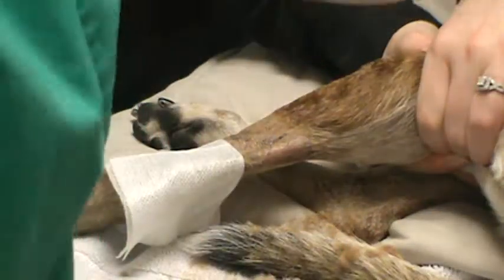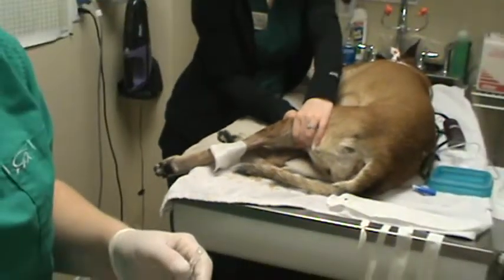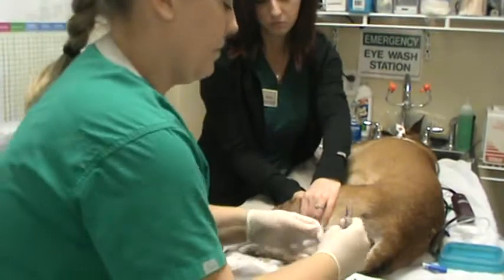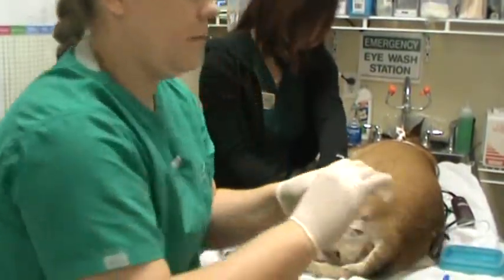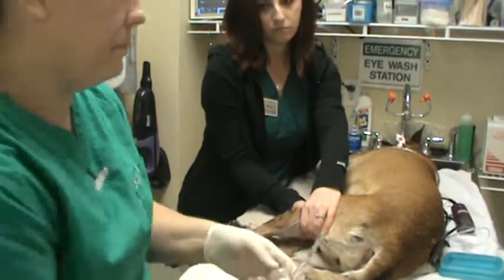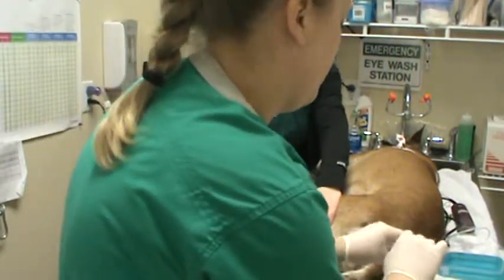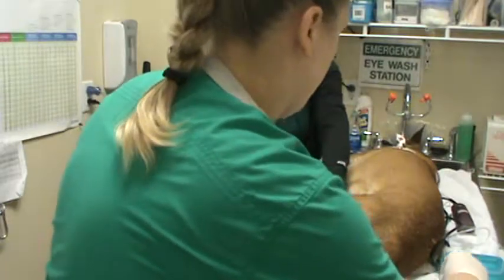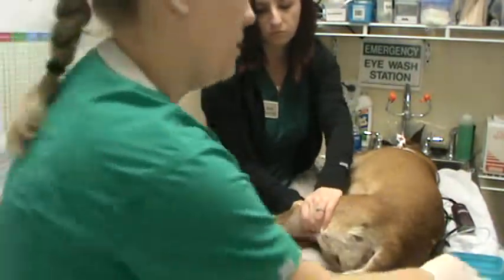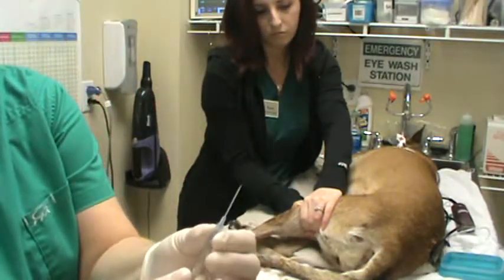We'll go ahead and open our catheter. We have that wrap too. I forgot to show you the vet wrap. We're going to flush our catheter. I'm zooming out a little bit so you can see me flush this. You can see it flushing there. Keeping that flush sterile because we want to go ahead and use that once we have our catheter in as well. Okay, so I have my catheter open and flushed, and it's coming off the stylet really easily.